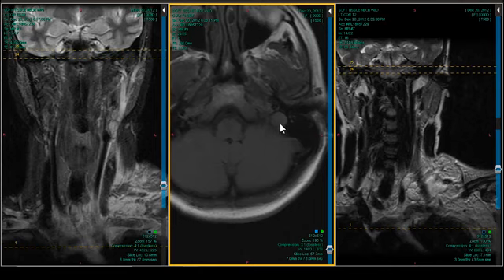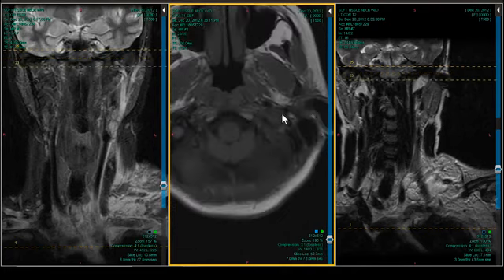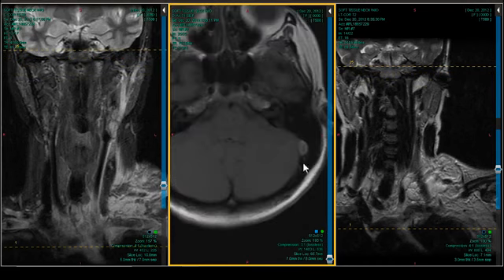Any comment on this? No, except when you get a neurosurgical consult to the labor and delivery suite, you are in deep trouble. And I've seen this, but I've seen it from the other end, that is, the same thing but presenting as a venous infarct. So you see the brain scan first. Sure. So that presenting as an acute neurologic deficit.